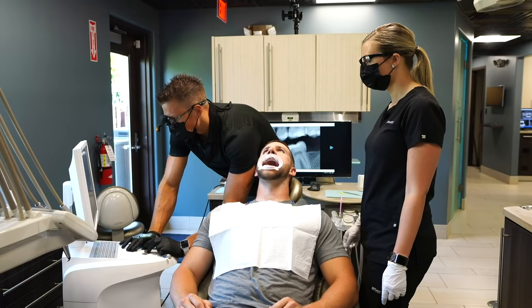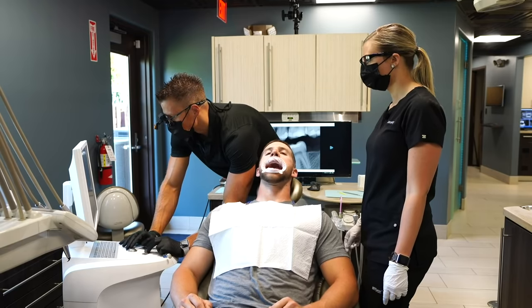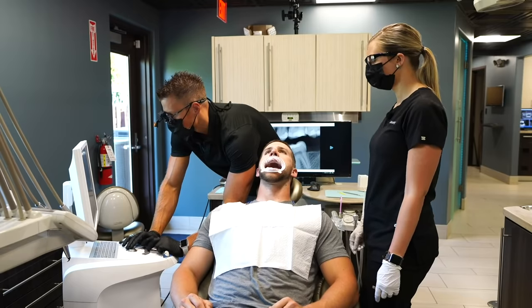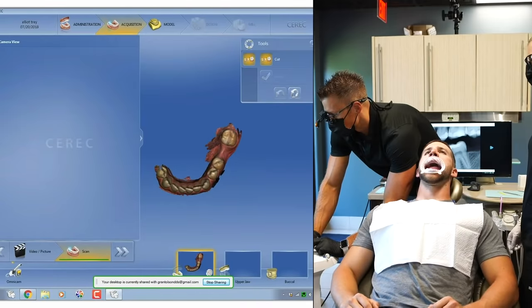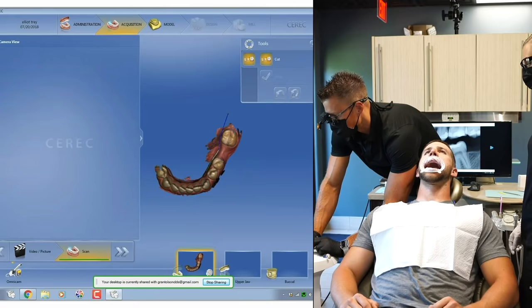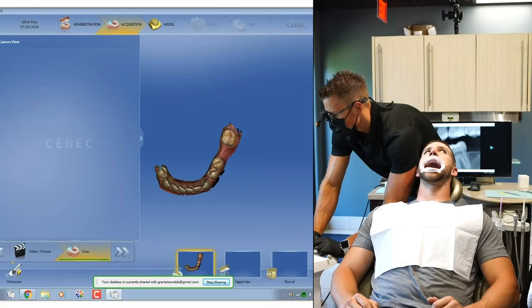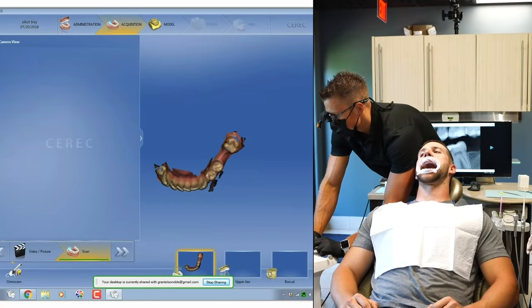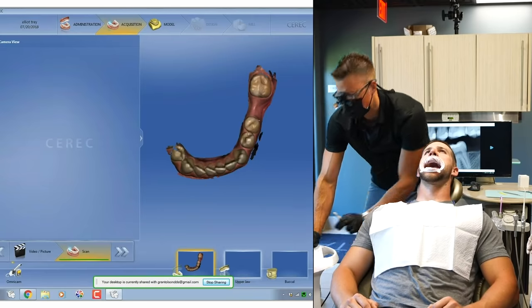So my hopes are, and I feel this way, obviously, and this might ruffle some feathers, but I'm more about giving the best patient education and care, and I really feel this way about this type of implant dentistry. When you really start to understand what it's doing for the patient and the accuracy and safety involved and the precision and way that we can restore the teeth, I would question why you'd want it done any other way. It's just so predictable, accurate, safe, when it's used, obviously, correctly by an experienced dentist knowing how to operate the technology. So there's our lower impression of the lower teeth.